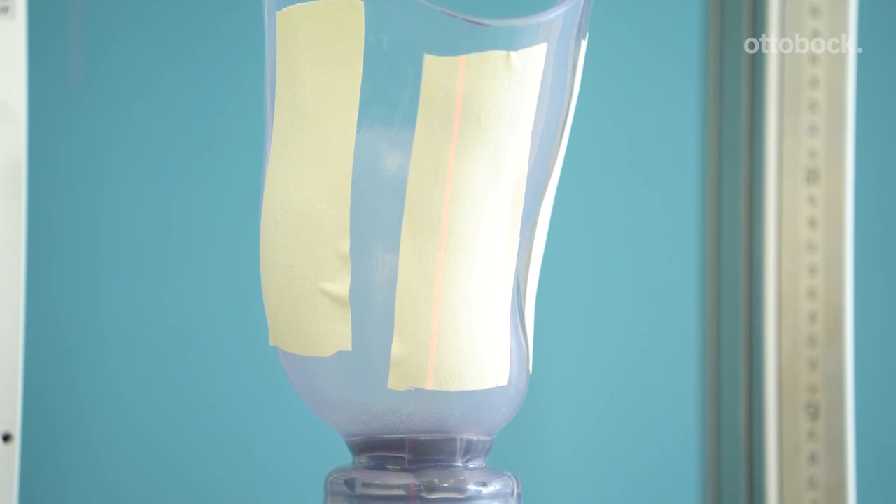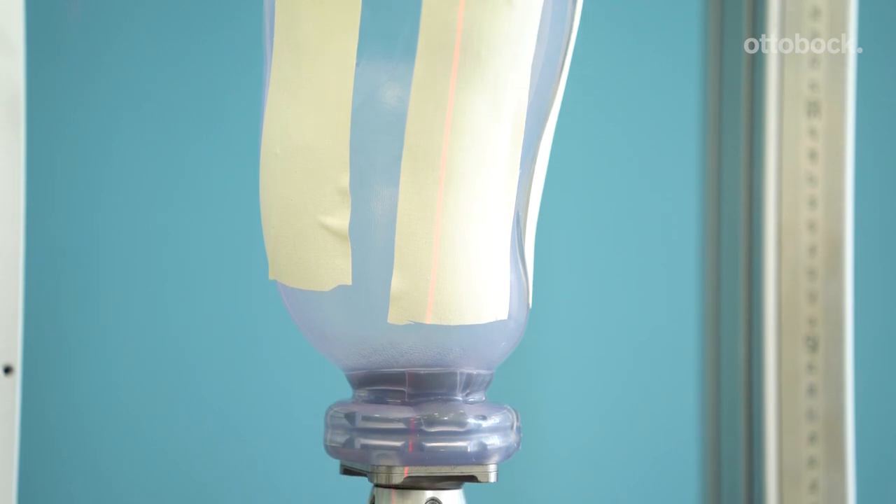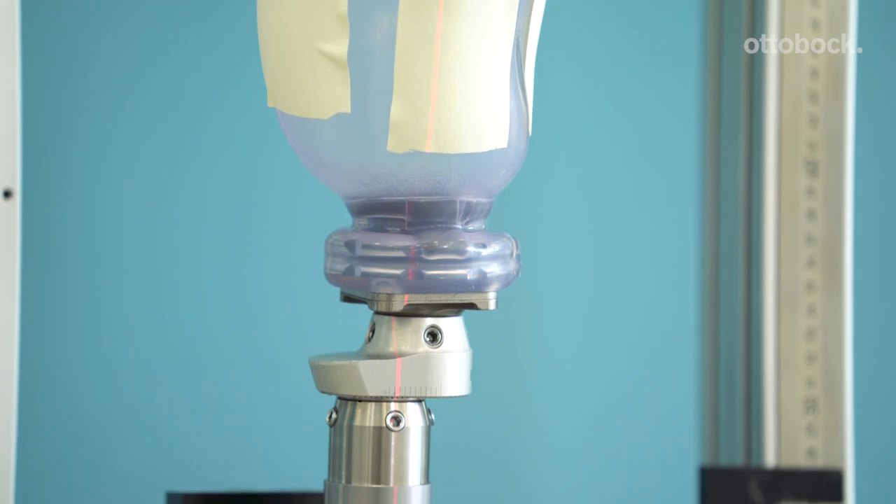When using the non-weight bearing 4R220=1 pump, you need to attach the appropriate socket adapter, such as the tech plate.